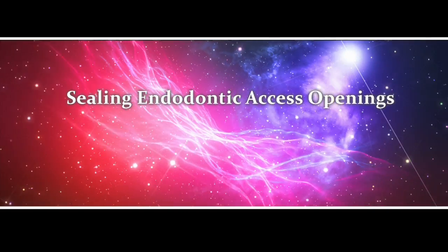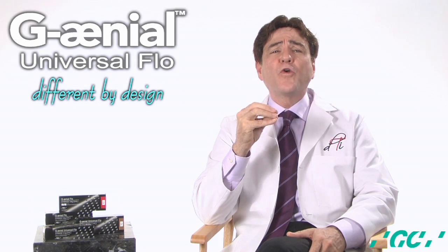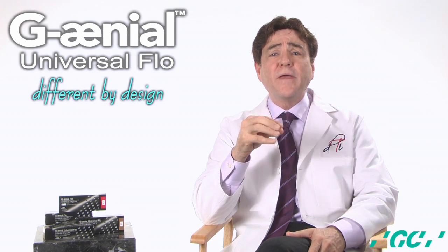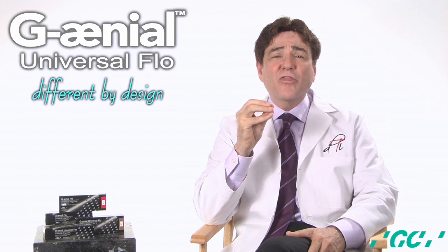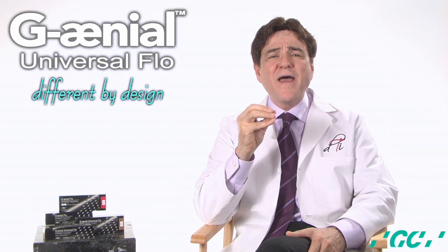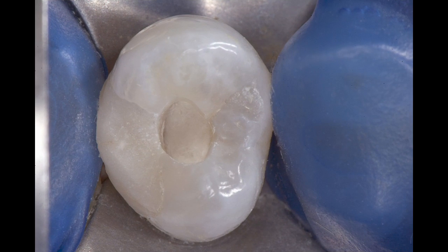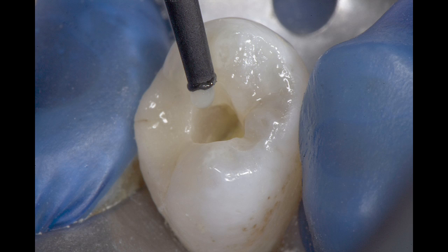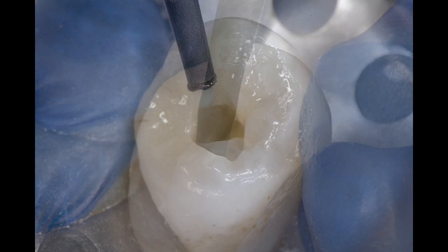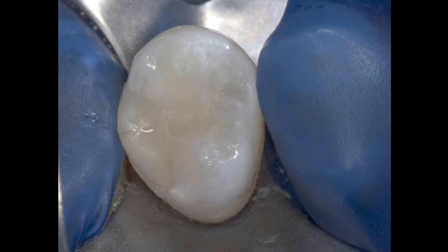Sealing endodontic access openings. An inadequate coronal seal after endodontic therapy can allow saliva to reach the apical region of the tooth in as little as 3 days. One material and method that can be utilized for sealing the endodontic access opening is a simple technique that involves self-etch adhesives such as G-aenial bond and a next-generation flowable. This bioadhesive procedure can restore or provide a transitional seal until a new restoration can be placed.